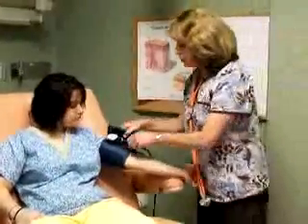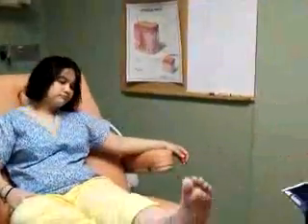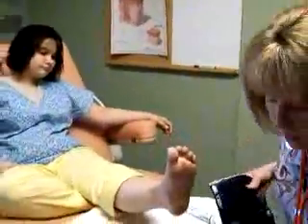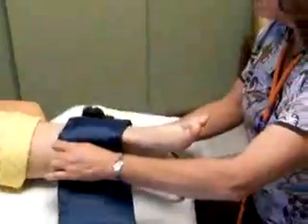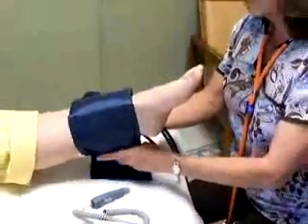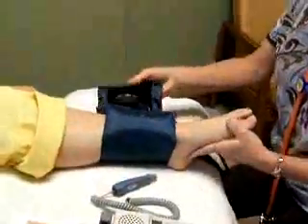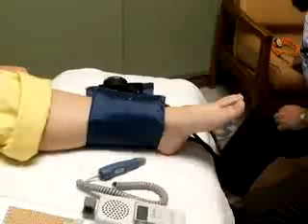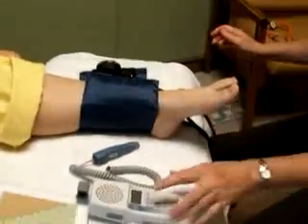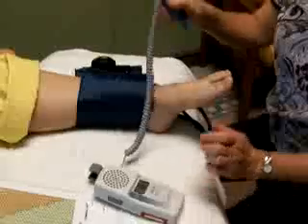Then you take the blood pressure cuff and you wrap it around the ankle. And if you have a wound on the ankle, it's fine to do it on top of that. You just cover the wound with a sterile gauze and then try to wipe the cuff off after that. Prior to inflating the cuff, you want to use your Doppler and locate the dorsalis pedis pulse.